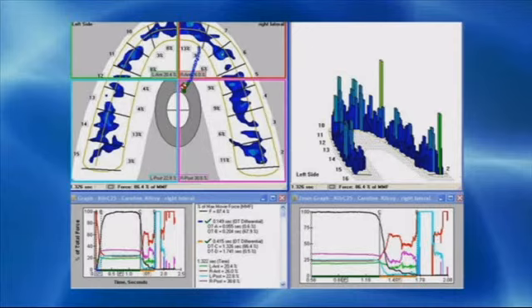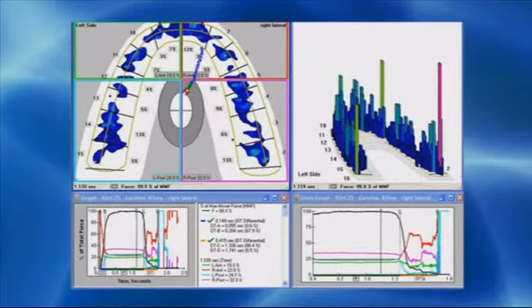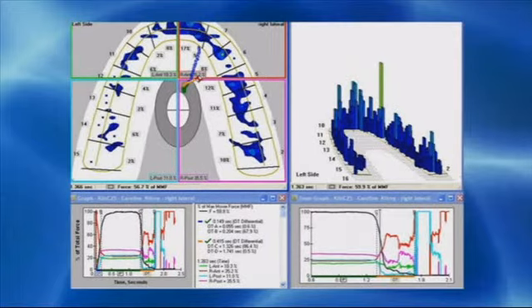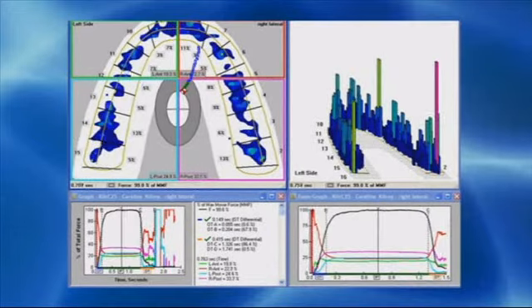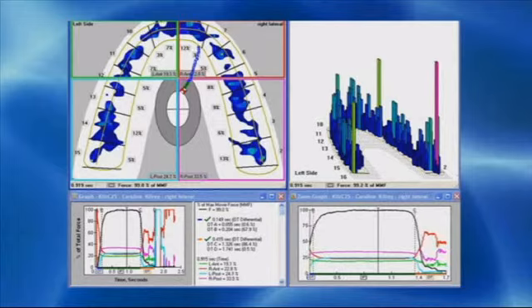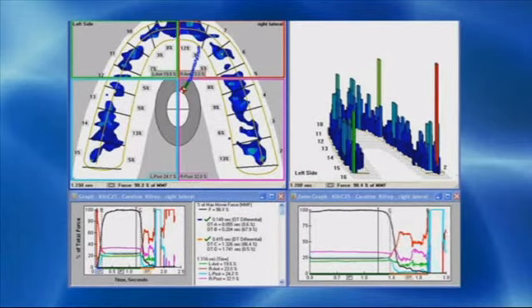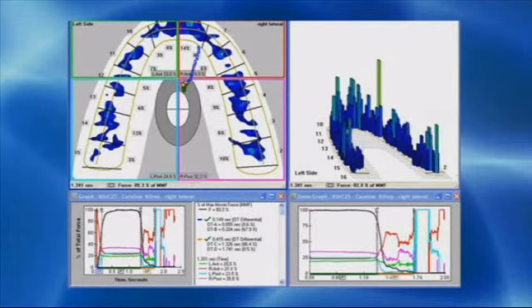The COF, the center of force, starts a little too far forward and it kind of moves outward and then moves backwards, and that indicates anterior pressure. And then in one of the movements, let me see, to the right, I believe, we have a little bit too much tooth contact when you move to the right again on the left side, which has been a battle with you to try to get those last few teeth to separate.